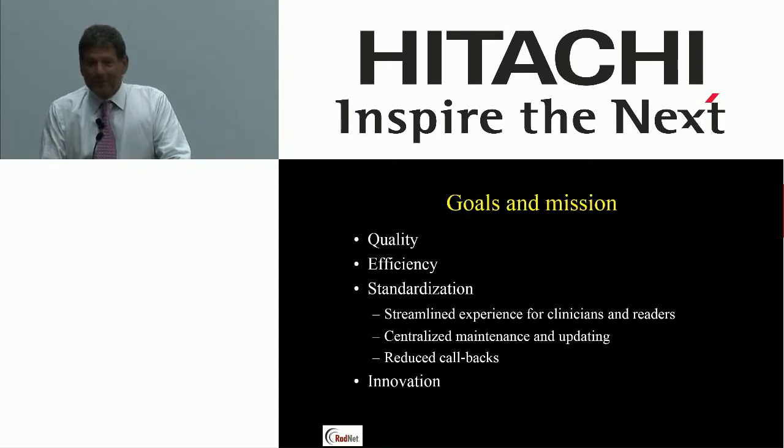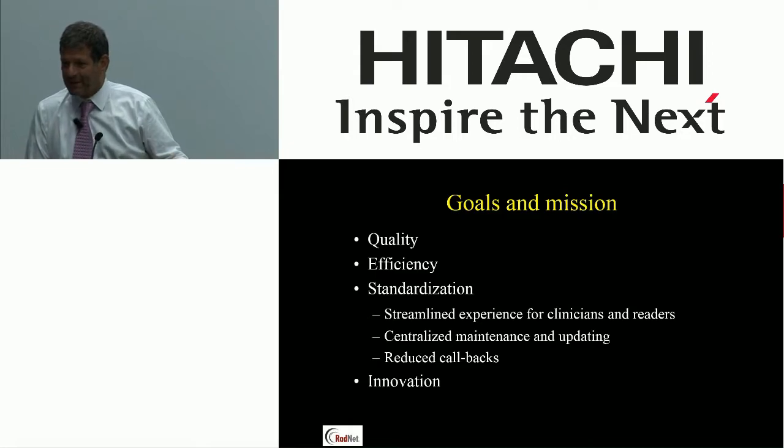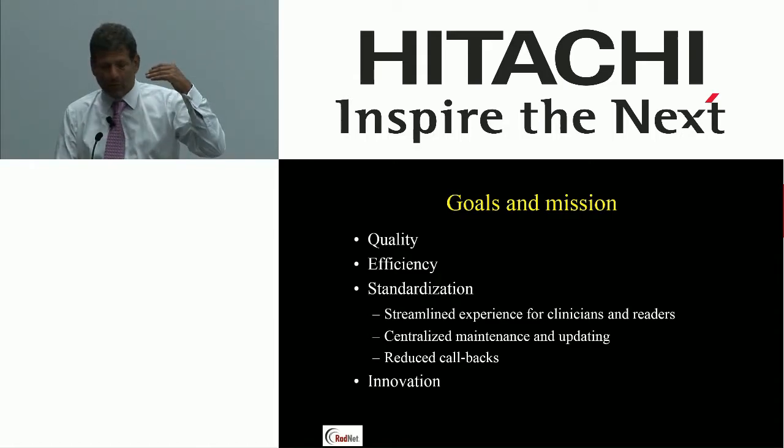All right, so standardization is a huge, huge thing for a big organization. I don't care if you're 3 hospitals or you're a regional hospital association, or if you're 310 centers. Standardization is a wonderful thing. You can look at it as standardization will set you free to do the special exam, but when things are standardized, the clinicians love it. They open it up. Here's my sequences. I don't have to worry about where things are.